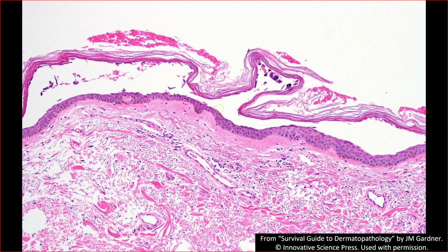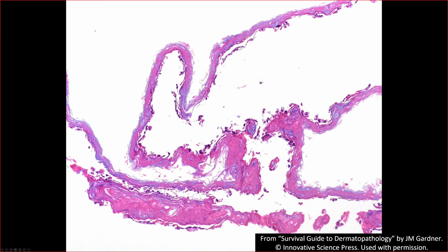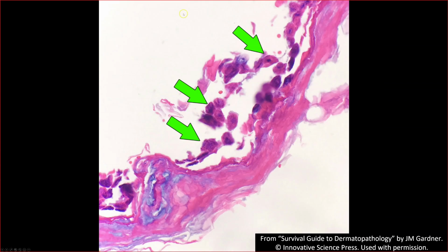So what you see is that same acantholysis and subcorneal split and blistering, but usually with no inflammation and without bacteria, because the bacteria are not here. They're distant in the body. And sometimes, of course, the roof can totally lift off, and you might at first not notice that there's not a corneum here. And if you look elsewhere on the slide, sometimes you can find the stratum corneum totally sloughed and split away. It's very characteristic in staph scalded skin to have that happen because of the diffuse nature of the skin sloughing and splitting. And there is acantholysis and rounding up of keratinocytes. Here you can tell this is happening in the actual granular layer because you can see the purple keratohyalin granules.